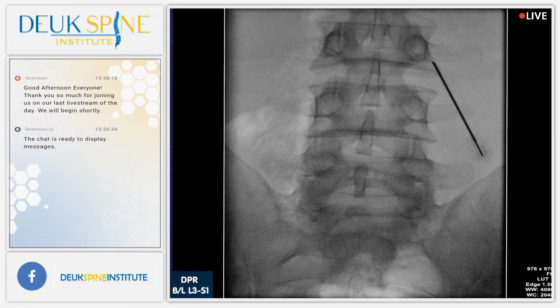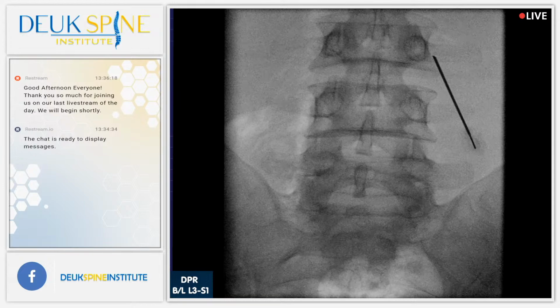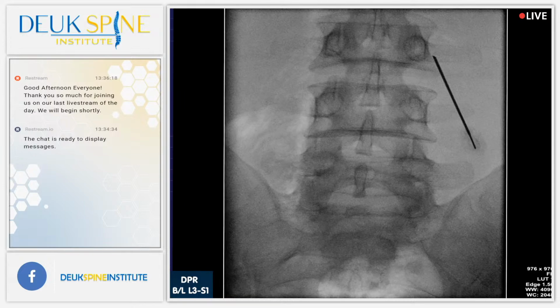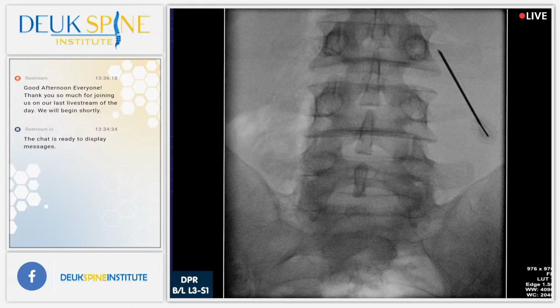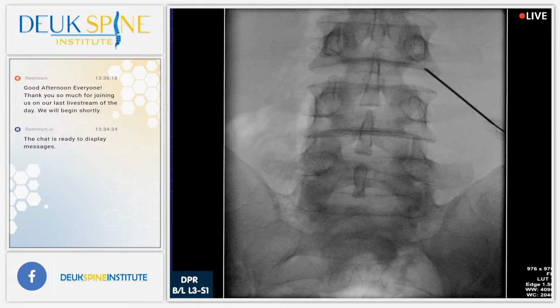It's too low. It's strange. Hitting the facet.